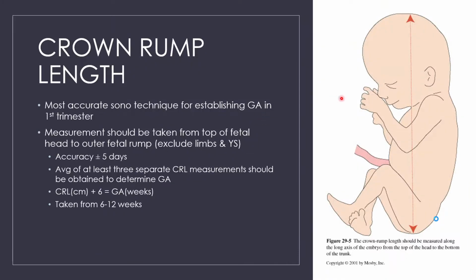Okay, this is just another schematic, just reiterating where we place those calipers. Remember, it is the most accurate measurement technique using ultrasound during that first trimester.